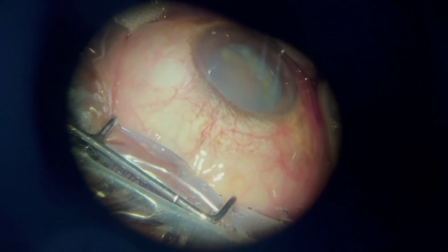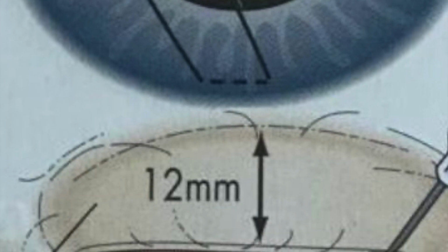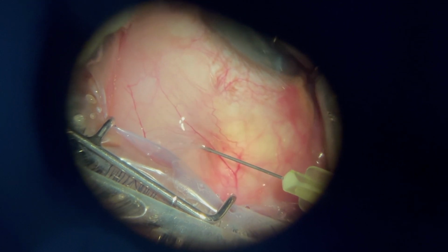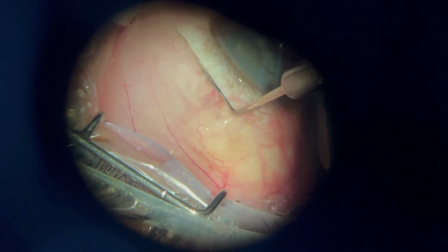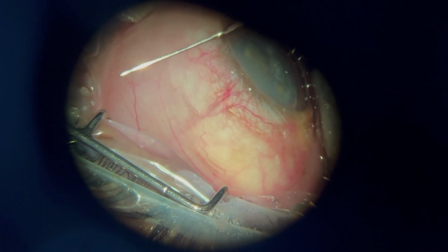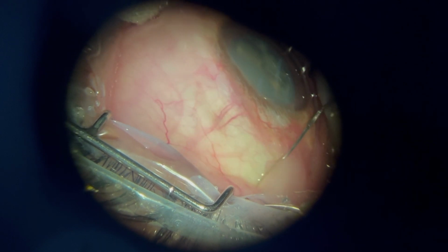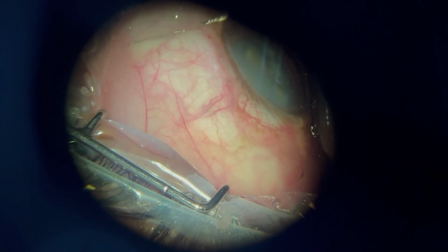Injection Mitomycin-C is given after corneal traction, 12 mm posterior to the limbus, subconjunctivally. The bolus can gently be spread across by spatula or muscle hook over the indented scleral flap area for 2 minutes. Then the steps of trab are carried out routinely.